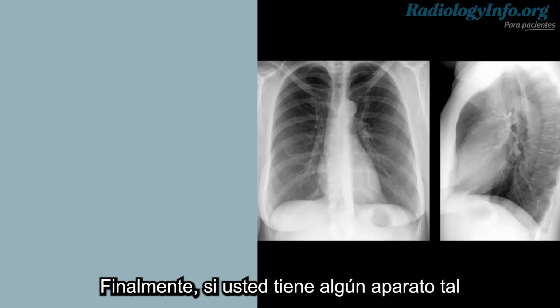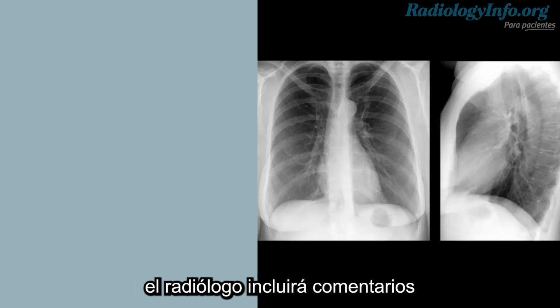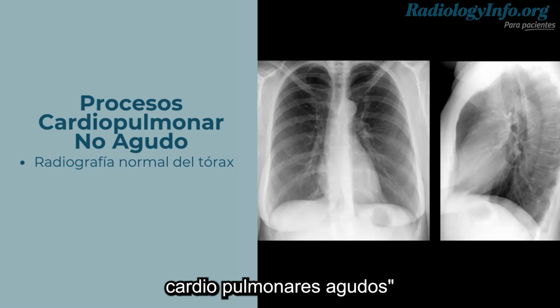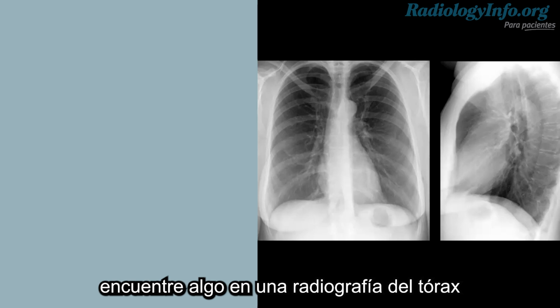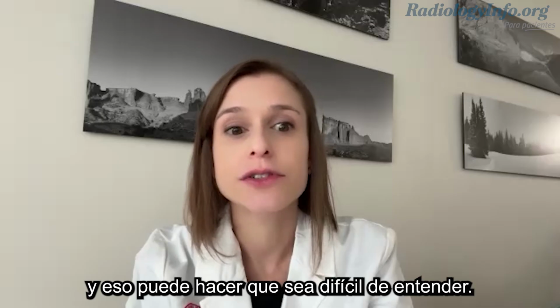Finally, if you had any devices such as a pacemaker, lines, catheters, ports, or tubes in place at the time of imaging, the radiologist will comment on their placement to make sure they were in good position. The impression section of your report summarizes the findings. If the radiologist does not see anything wrong, it may say no acute cardiopulmonary process or normal chest radiograph. Keep in mind it is common for a radiologist to make a finding on a chest x-ray that may need further imaging. Remember, your radiology report is written for your healthcare provider, and that can make it challenging to understand.